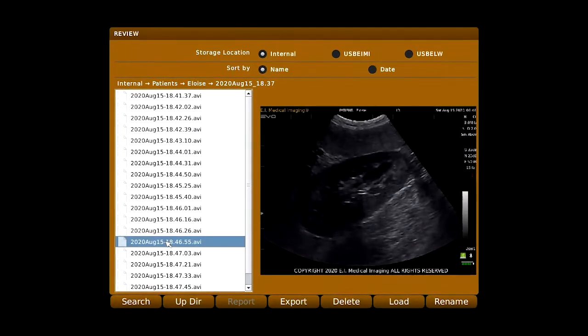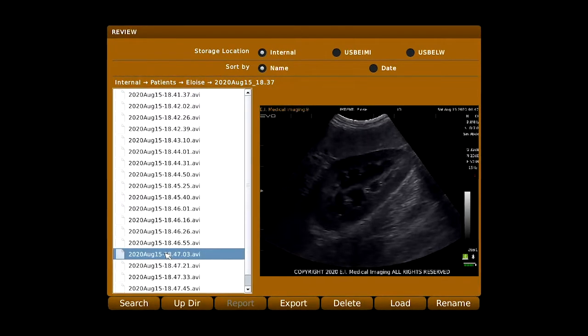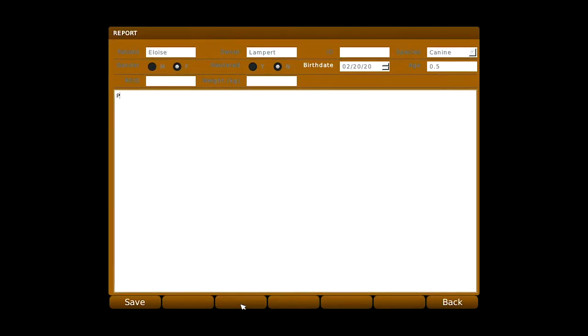Create patient profiles and review images from a menu where you can rename, edit, delete, and export files after the exam has concluded. Even write a report to accompany the images from an exam.